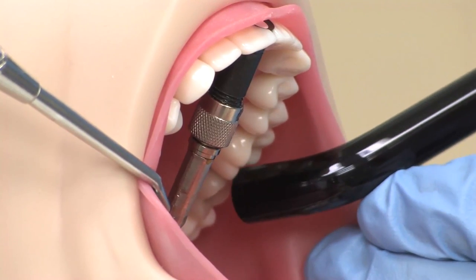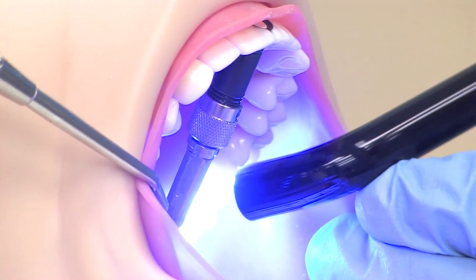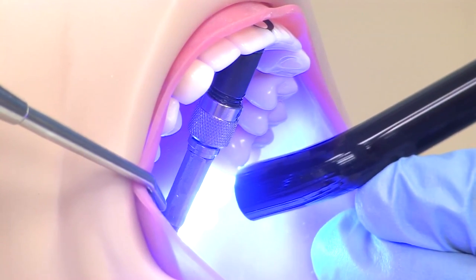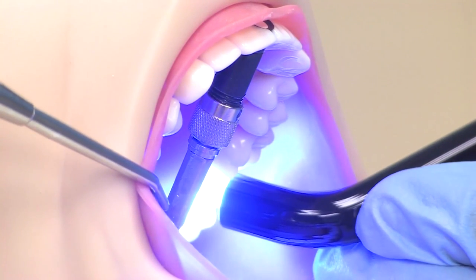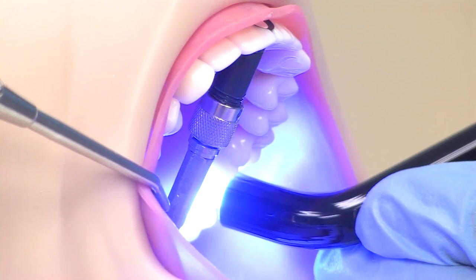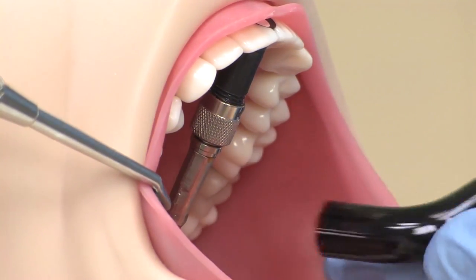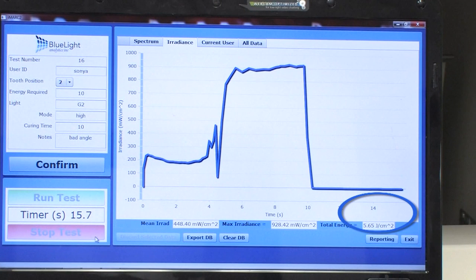This shows what happens when the light guide is held at an angle and then corrected. Can you put the guide perpendicular to the restoration? Perfect. We see the effect on the real-time energy graph. Here we can see we're delivering 5.7 joules per cm² of energy.